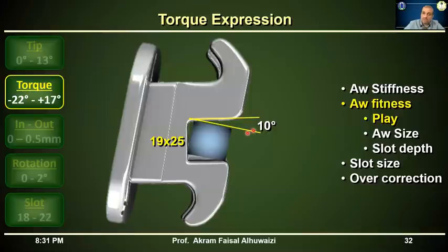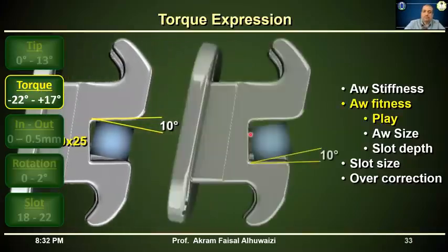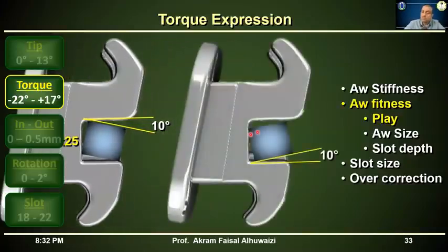That's a huge amount of loss of torque. And of course, it works both ways, whether we're giving a positive torque or a negative torque. We lose both ways.